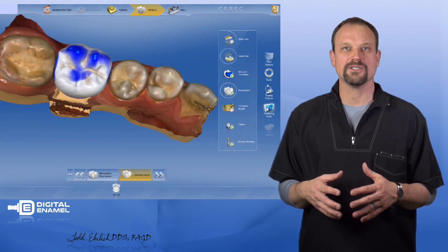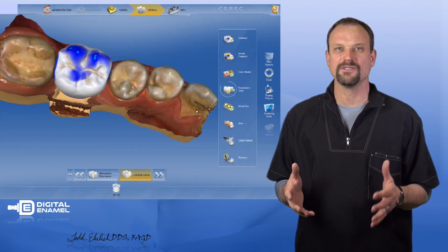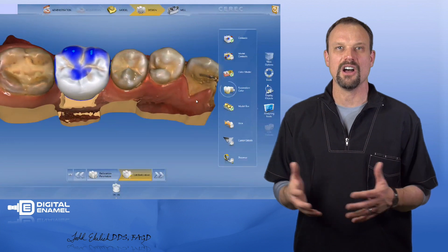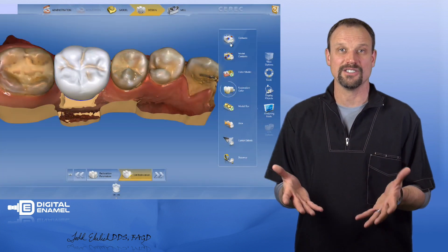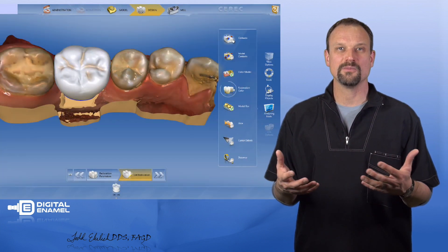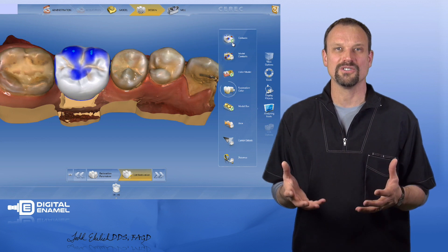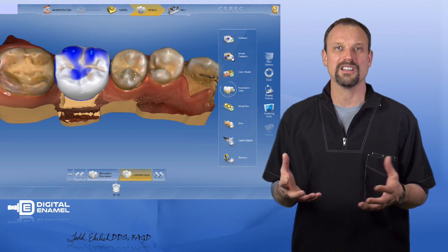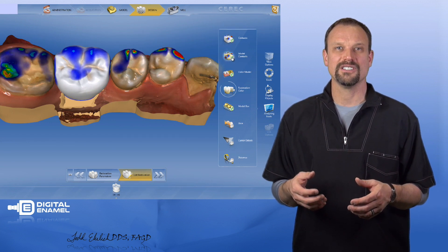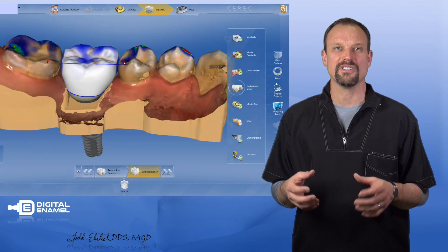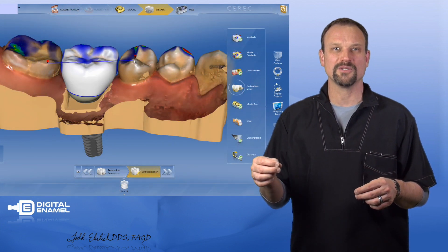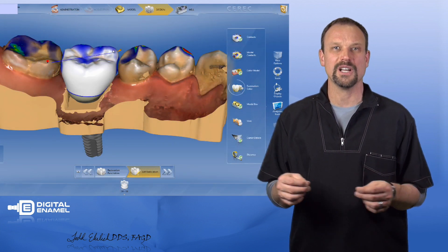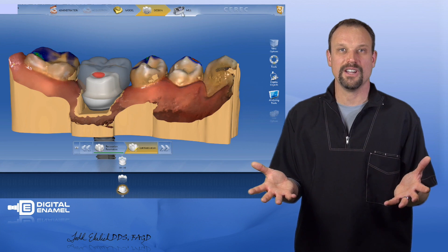The next button down is called analyzing tools. This gives us a lot of options to analyze the situation: our interproximal contact and occlusal contact intensities. There is a distance tool which can measure the distance from one cusp tip to another cusp tip. That's it with the design phase.